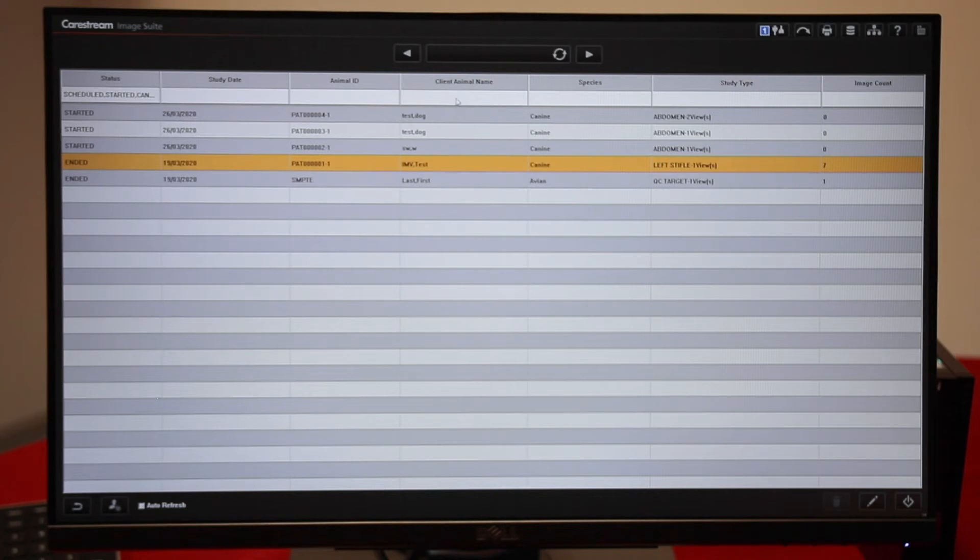From here you can do a search. You can search by date. Often it's very useful to search by name.